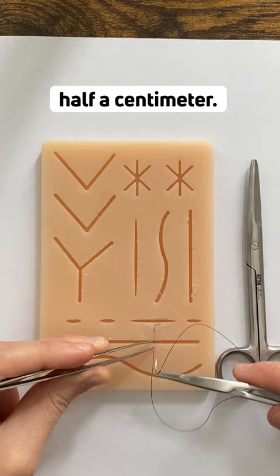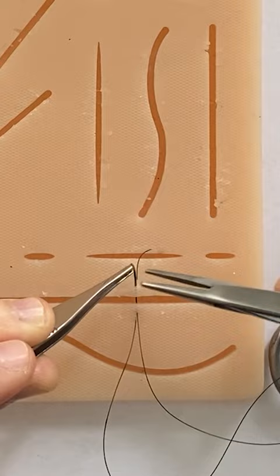Then we pull the needle out and tie our suture. And that's the vertical mattress.